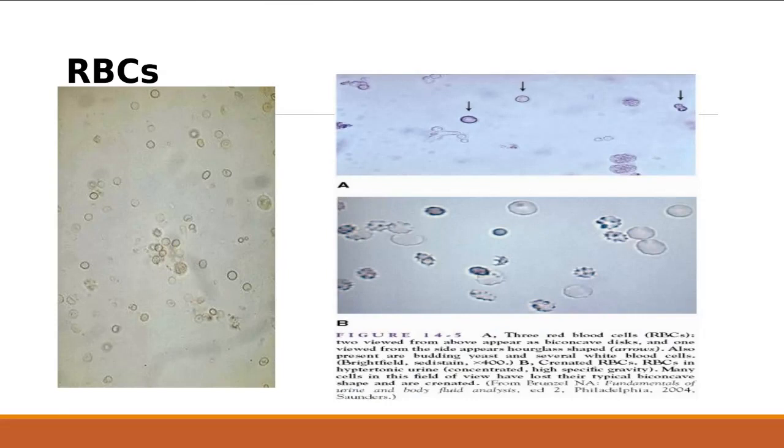I'm not sure how long I've been going, but I'm going to go ahead and take a stop since we've talked about what we look at in the low power field, and then I'll talk about the high power field in just a minute.